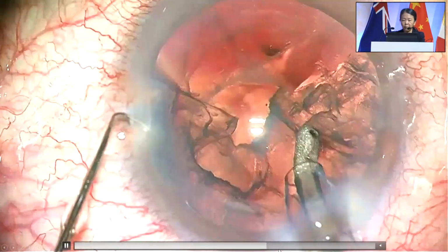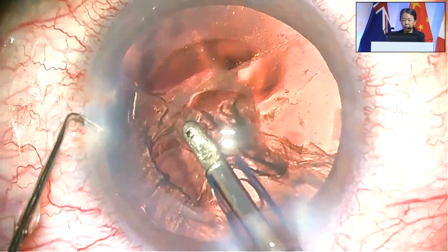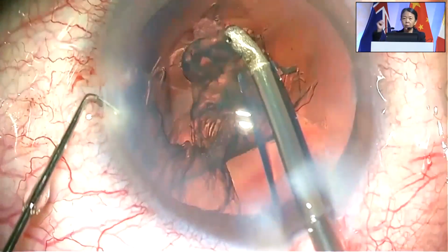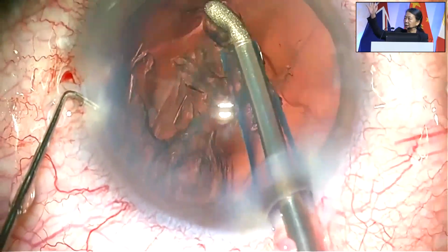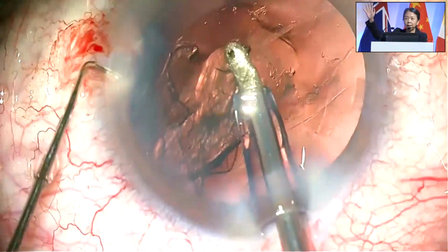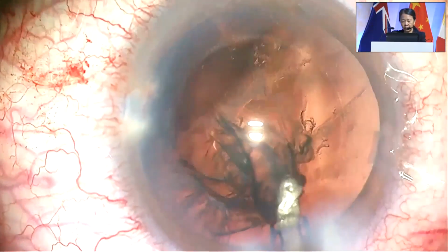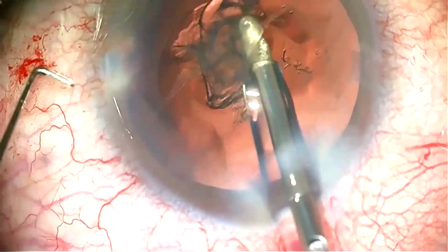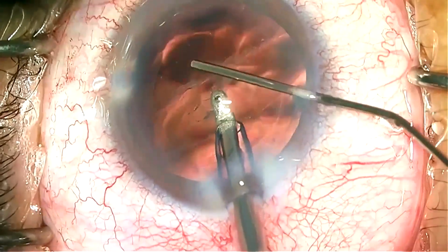So how many of you would go ahead with a trifocal lens? In this case, it's non-toric. How many would go ahead with that? One hand, two hands, a few hands. Okay, definitely not the majority. Dr. Chee, the problem would be if this is the first case, and I put a trifocal lens in this, I never know what will happen to the other eye, which is also posterior polar. Okay, exactly. I'm going to show you the other eye after this.